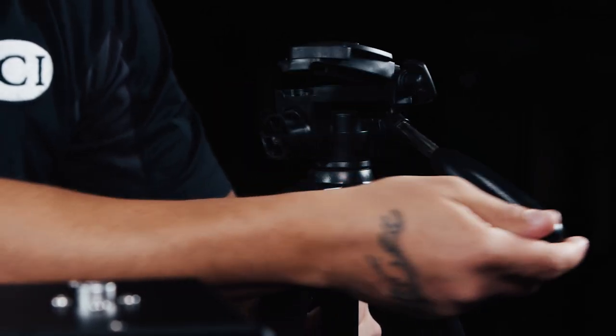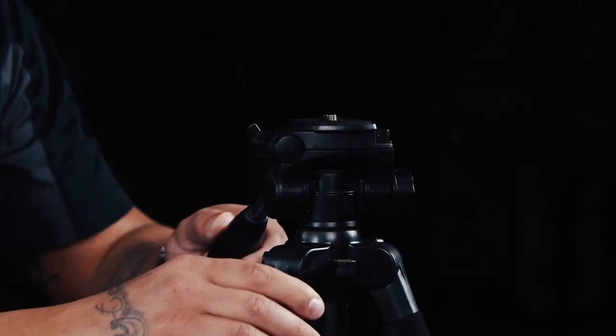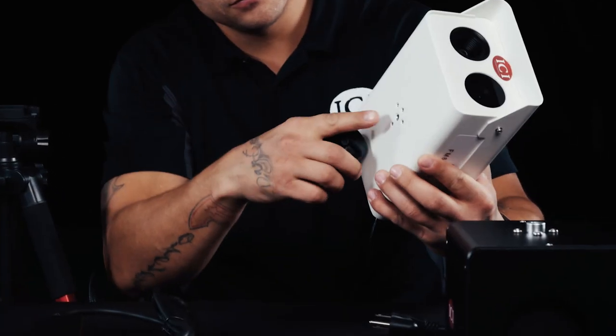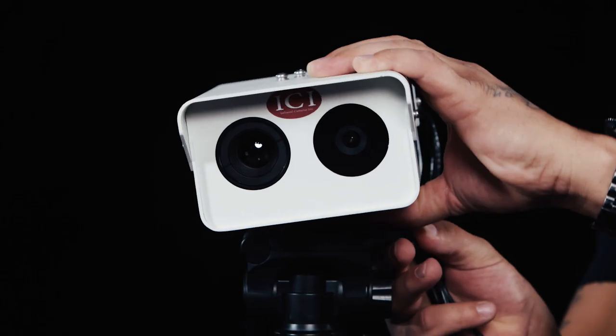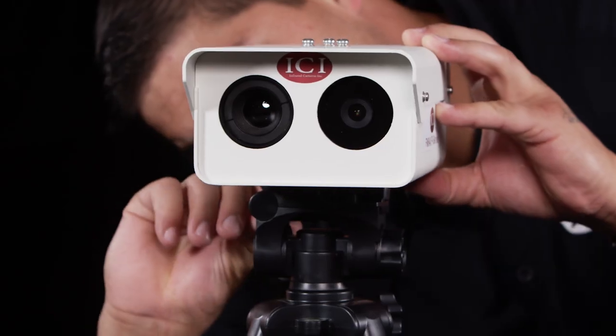There are pan and tilt adjustments that you can make. Be sure to lock down the unit so that it won't move once it's been set up. Detach and attach the adapter to connect the base to the camera. Attach the adapter to the camera temperature reference device before reattaching it to the tripod.